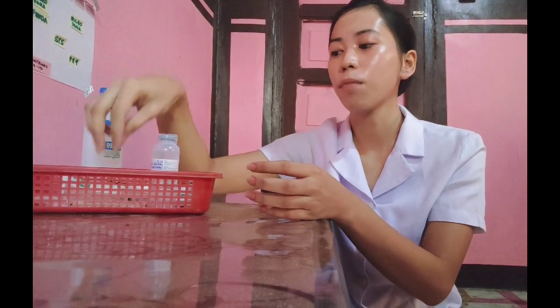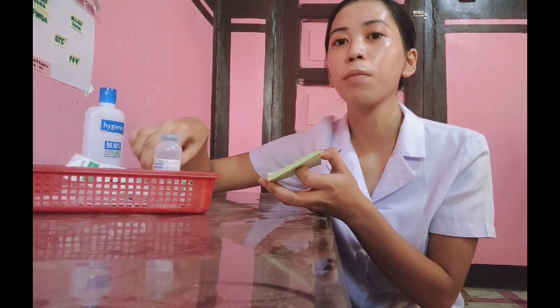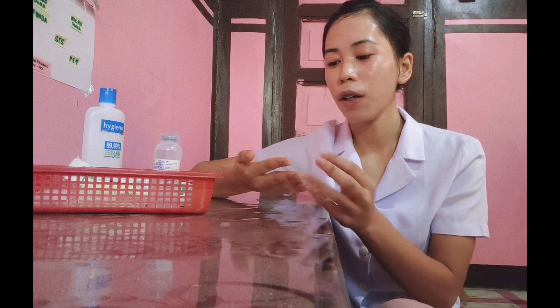And then check the MAR or the medication card. Check the label on the vial carefully against the MAR to make sure that the correct medication is being prepared. And then we will follow the 3 checks for administering medication. First is when it is taken from the medication card. Second is before withdrawing the medication. And the last is after withdrawing the medication.